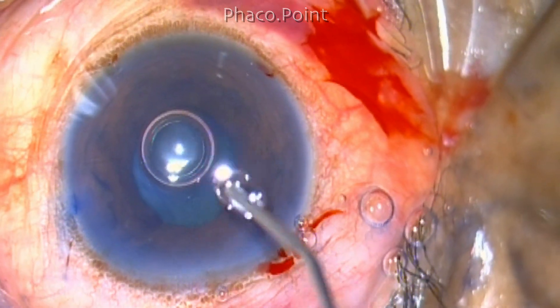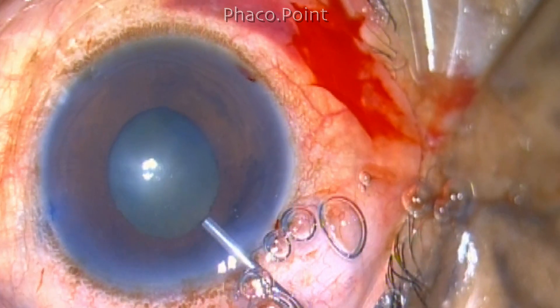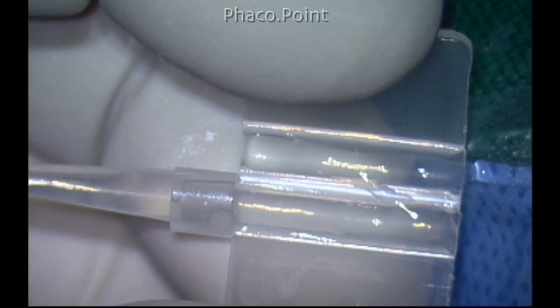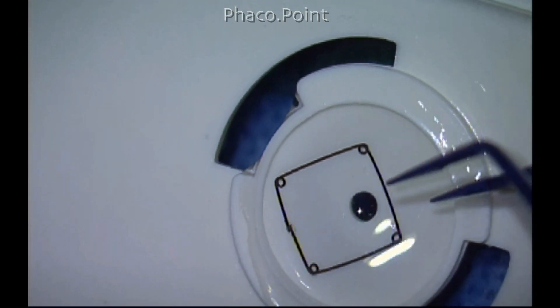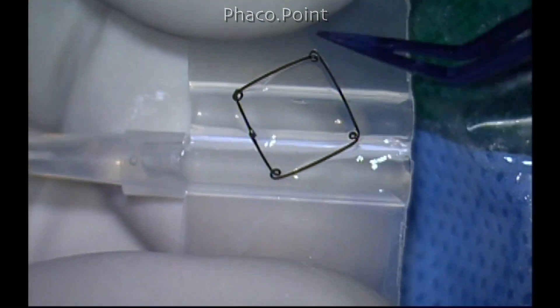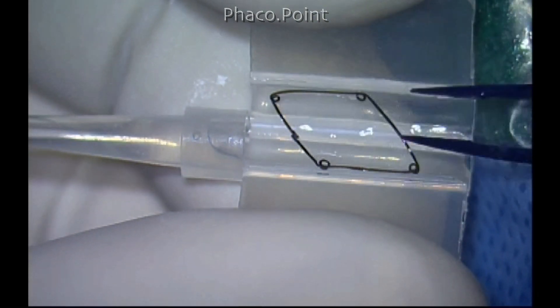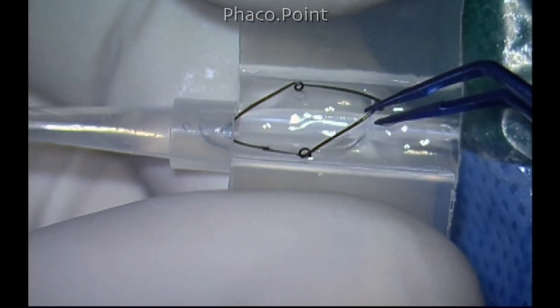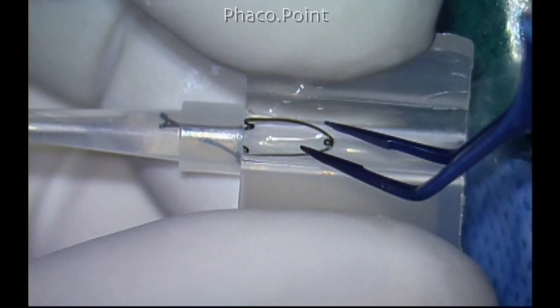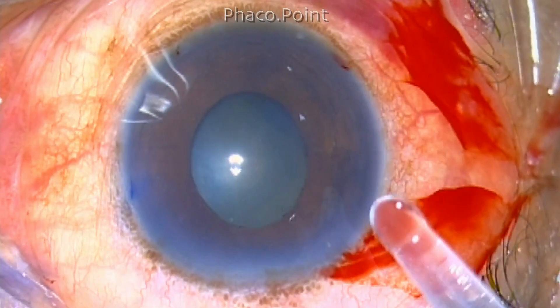Once the clear corneal incision is completed, the next step is to implant the pupil dilating device. I prefer the Gupta ring, which can be injected using a butterfly cartridge — very similar to the one used for Indian foldable lenses. A little viscoelastic is placed into the barrel of the cartridge, the ring is fed into the injector in a diamond configuration. It requires a little skill to feed the loops right into the barrel to enable easy delivery into the anterior chamber. Once done, the device is ready for injection.